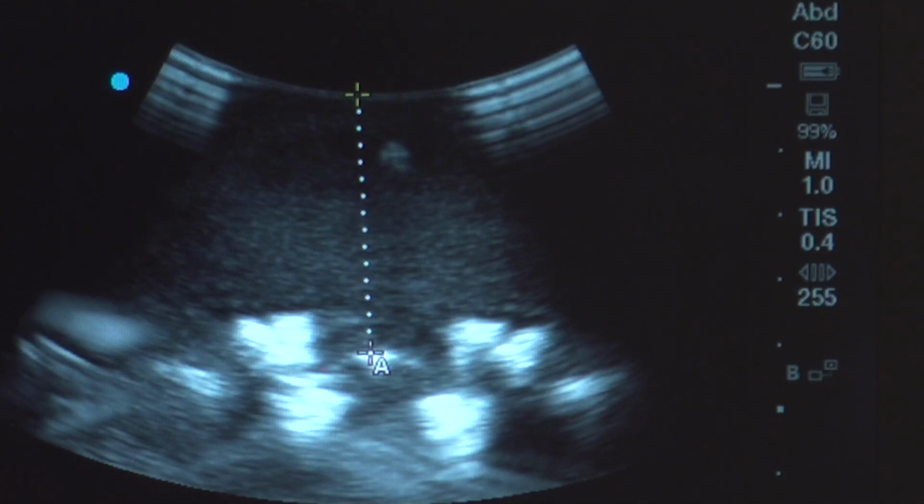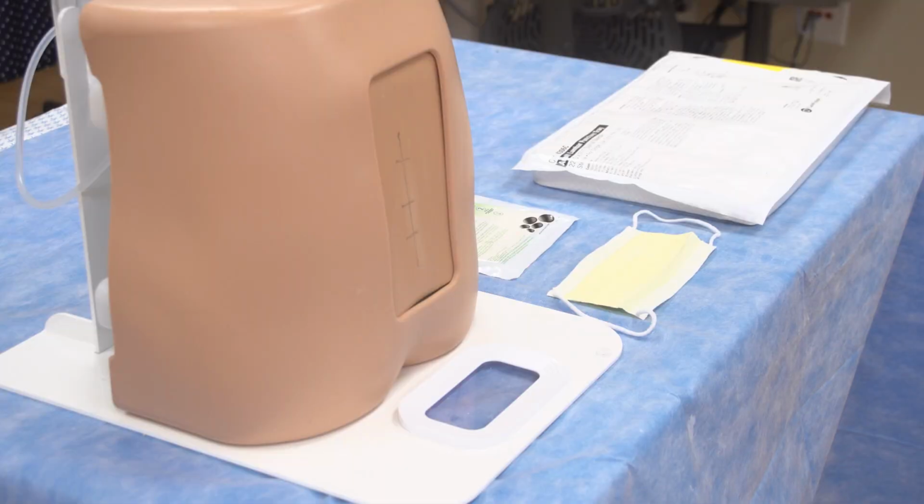With a few repetitions, the entire process of static guidance and depth visualization can take less than 5 minutes and provide confidence and preparation for a successful lumbar puncture. Now that we've mapped the spine, let's perform the procedure. We often teach that lumbar puncture is 70% preparation and 30% execution.